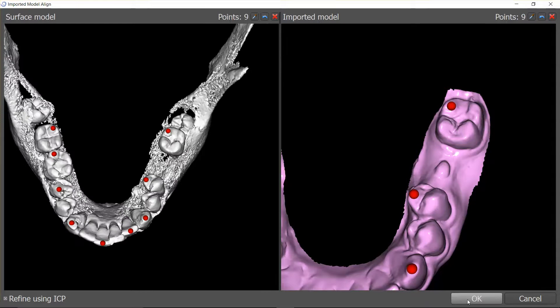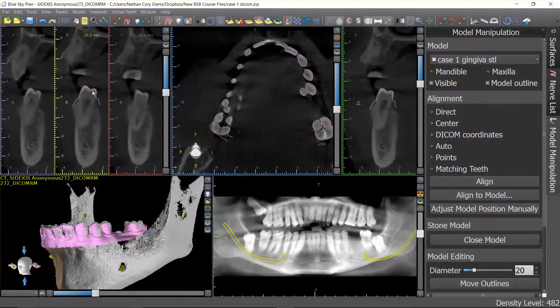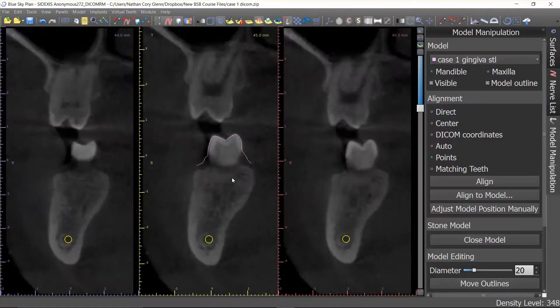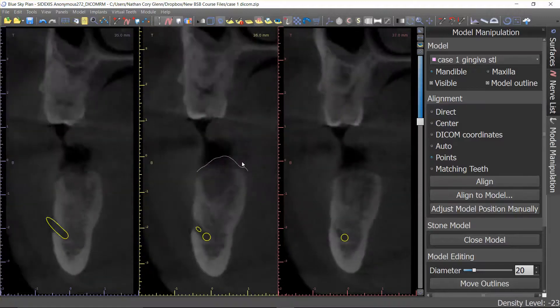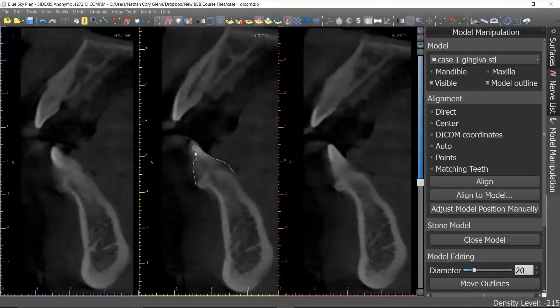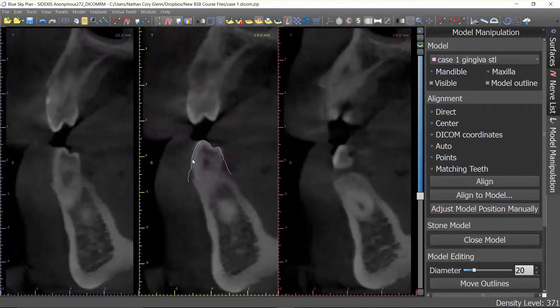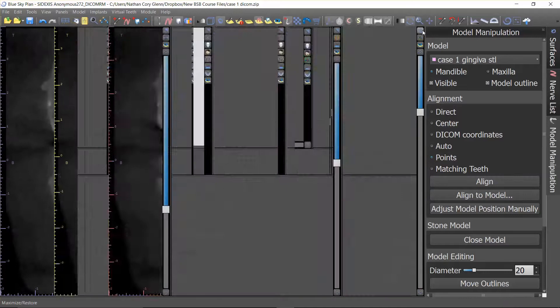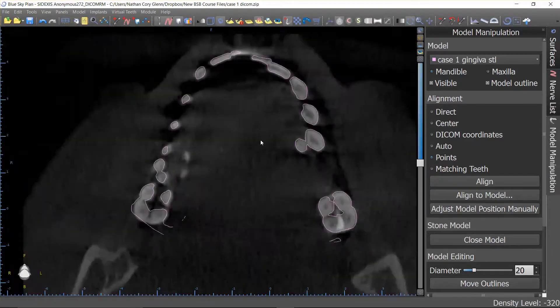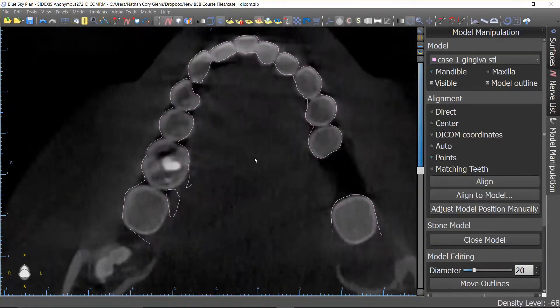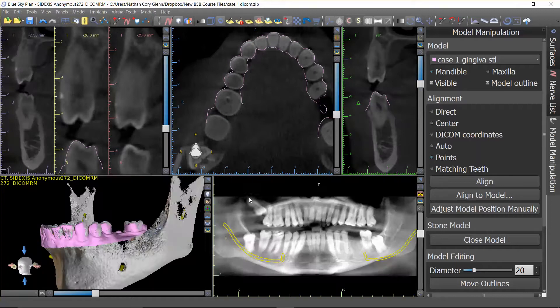Now when I do this, watch the alignment of that model outline change. Did you see that? It was quick, but now if I look at the model outline it is much more tightly adapted, and I can scroll through the arch and see this tight adaptation throughout the entire scan. Anteriorly, posteriorly — it doesn't seem to matter where I am, it is adapted tightly. Sometimes you'll end up with a nice adaptation in the posterior or anterior but not on the opposite side of the arch. Same thing with the axial view — scrolling up and down, the cusp tips disappear at the exact same rate as the model outline. So this is a good stitch; I am comfortable with this.